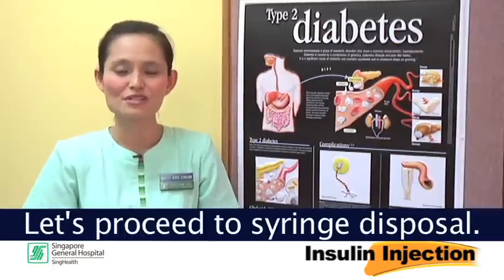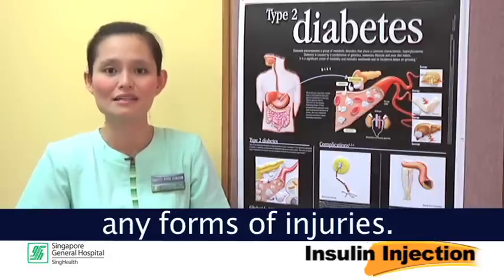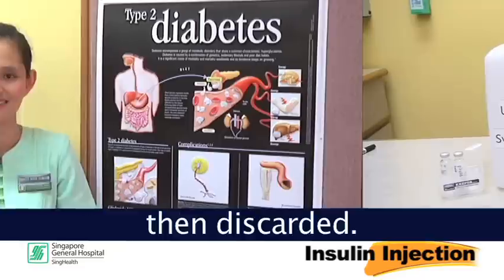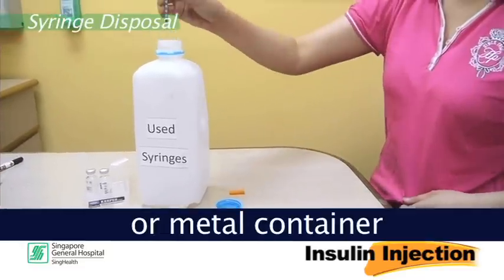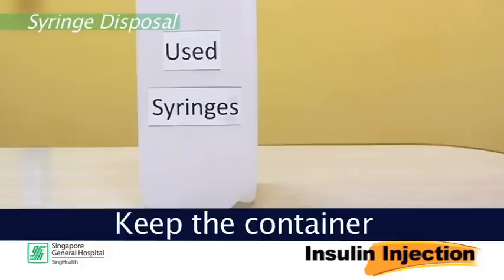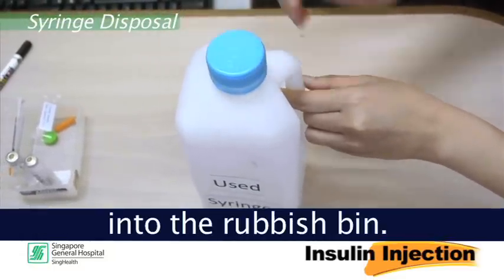Let us proceed to syringe disposal. After each insulin injection, you will need to discard your insulin syringes appropriately to prevent any forms of injuries. Remember, insulin syringes are only meant to be used just once, then discarded. Dispose syringes into a hard plastic or metal container with a screw-on or tightly secured lid. Label that container as used syringes. Keep the container away from children. When it is full, seal the container and discard it into the rubbish bin.